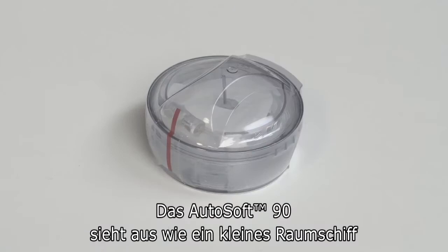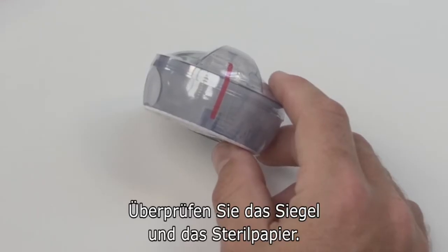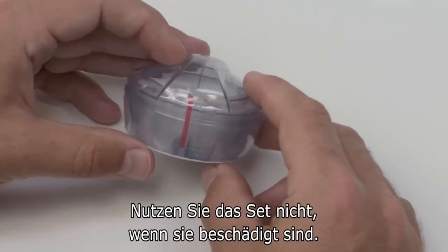The AutoSoft 90 comes packaged in this cool little spaceship design, which contains the set, the tubing, and the inserter all together. Before you begin, check the tamper-proof seal and sterile paper. Do not use if the seal or paper have been broken.